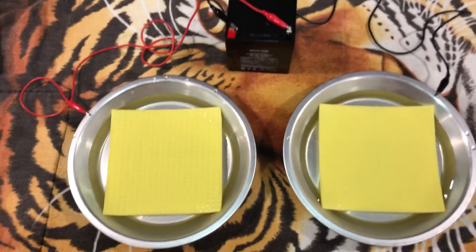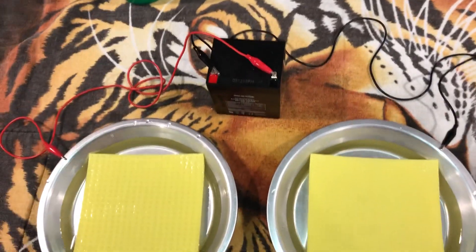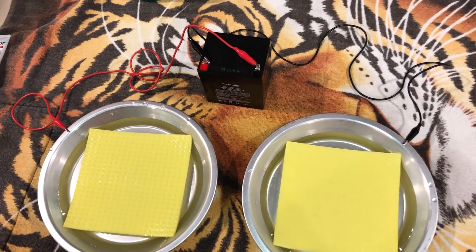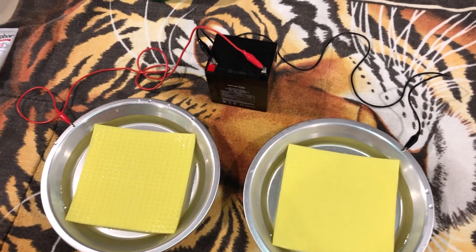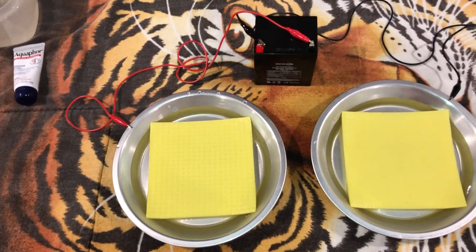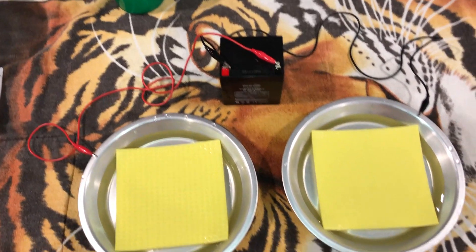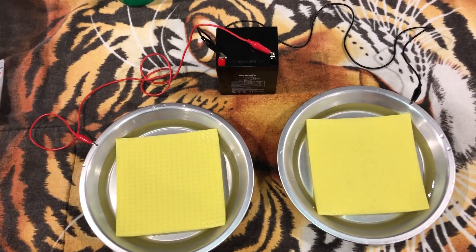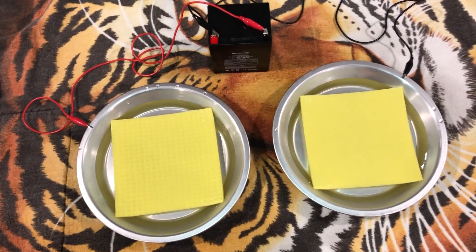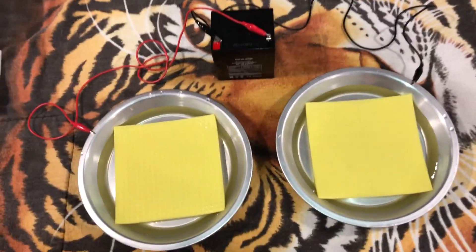After that you're good. It's kind of up to you on your routine. I started every other day, 20 minutes each way, then took it down to 10 minutes each when it started working and I saw results. Now I only have to do it once or twice every two weeks to keep it working.